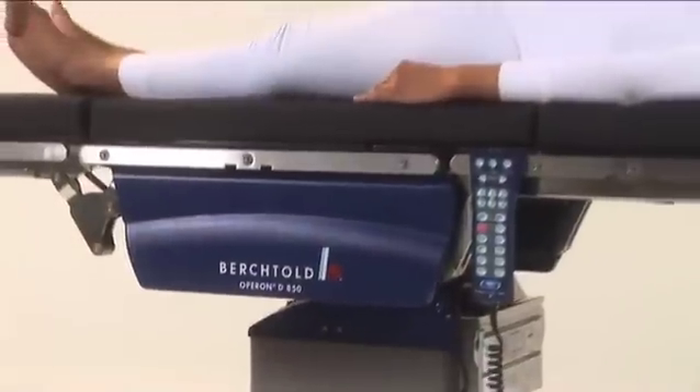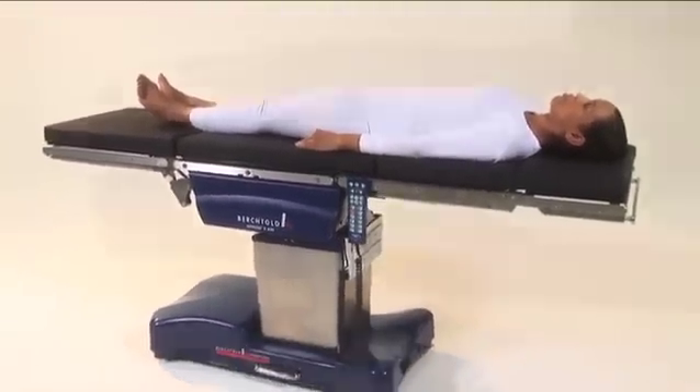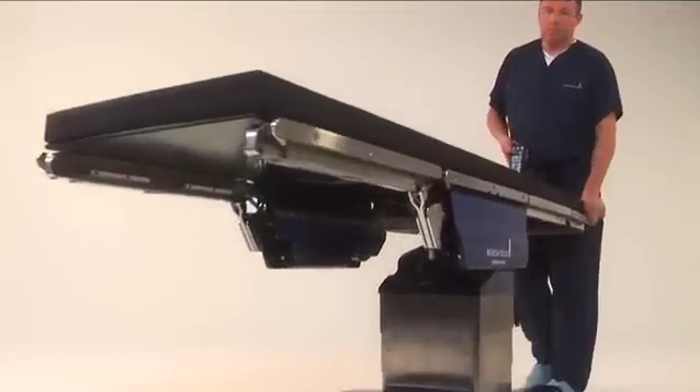The D850 is equipped with safety features designed to protect the patient and the caregiver, including self-compensating floor locks, anti-collision sensors, manual auxiliary hydraulic power, and InstaDrive, the table's self-propelled drive capability.